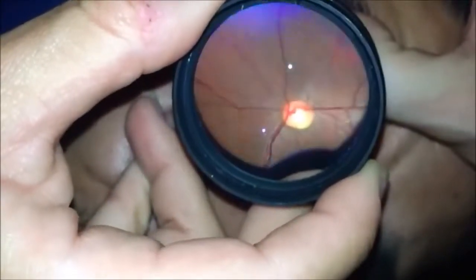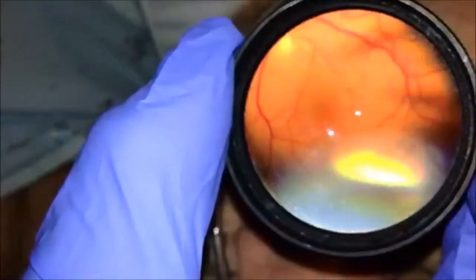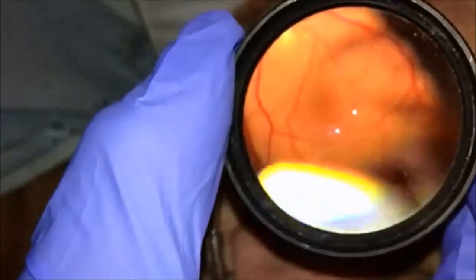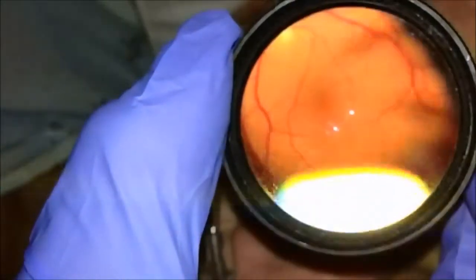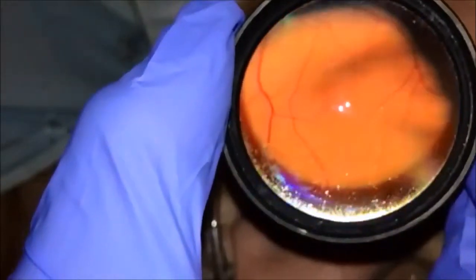The technique can be used at the clinic or any place you find suitable for a screening. The technique can also assist screening efforts in different medical systems, and with the advances of telemedicine, it can be a useful aid to prevent contemporary global health problems.